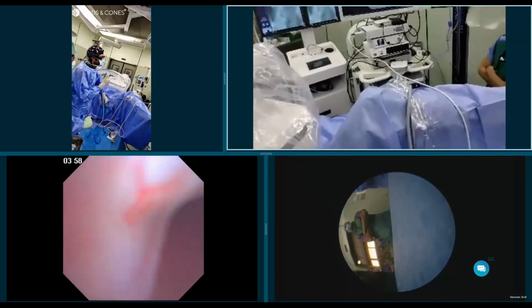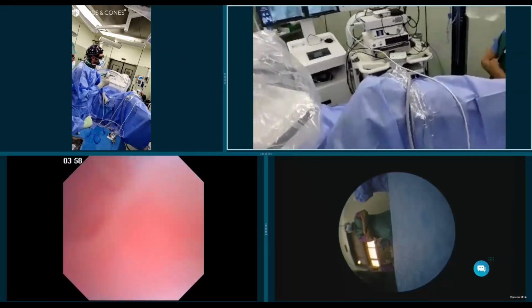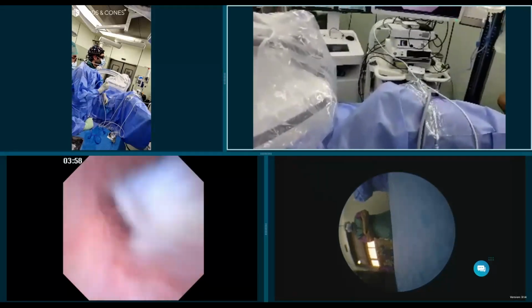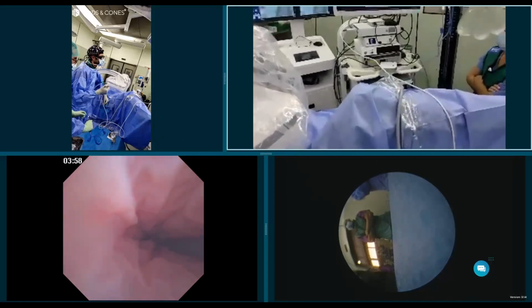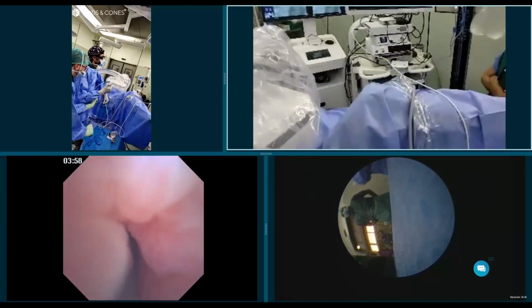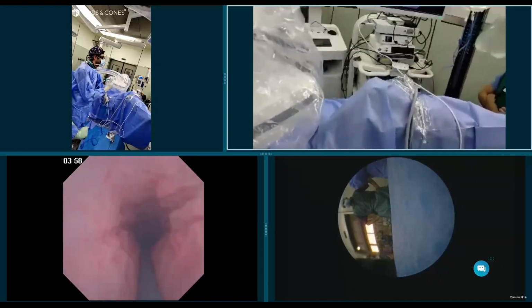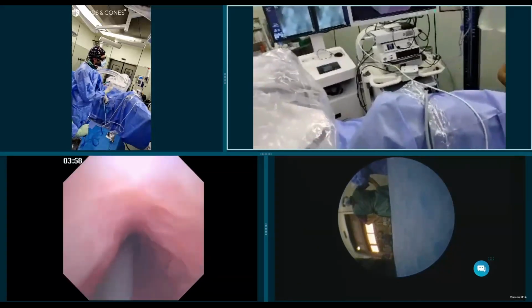So we're going to connect it, and we're going to see how it clears the view, which is one of the main advantages. Okay, so I'm going to get into the kidney. Fortunately, this patient was pre-stented, but remember that this 7.5 French is made to go into ureters that are not pre-stented, so you can get an easy access and avoid any failure of access, which are small, less than 10%, but with this 7.5, you reduce it to a minimum, so there are no access failures.